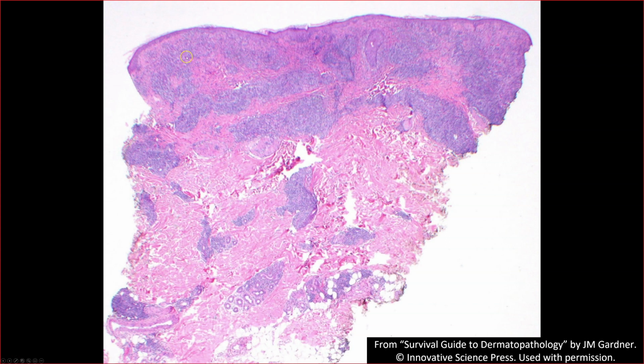Thick, lichenoid band. Almost you could start thinking of lymphoma. In fact, I think this was a case that clinically they were worried either infection or lymphoma because it was so florid and the lesions were so indurated and juicy. Perivascular, superficial, and deep is really helpful.